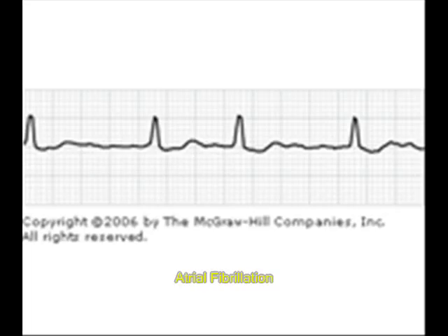Now you can see this one — this is atrial fibrillation. In atrial fibrillation there is an irregularly irregular rhythm; the atria are contracting very irregularly. In atrial fibrillation the atria just contract irregularly and that needs to be treated with medications like diltiazem.